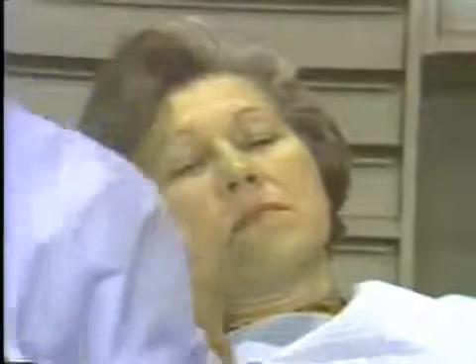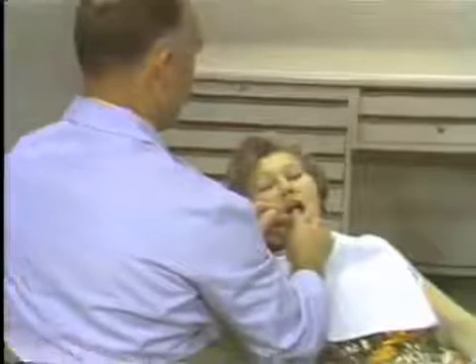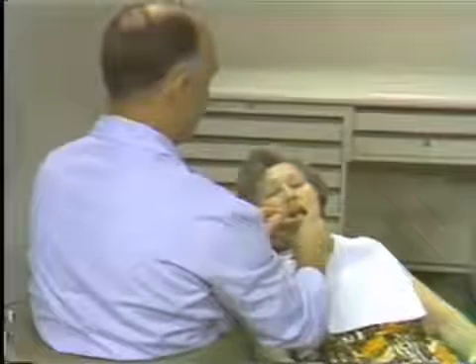Besides those items, this position of the patient and operator are excellent for the lower anteriors. Direct work can be done with direct vision, and with the use of the mirror, a good access and visibility is apparent.